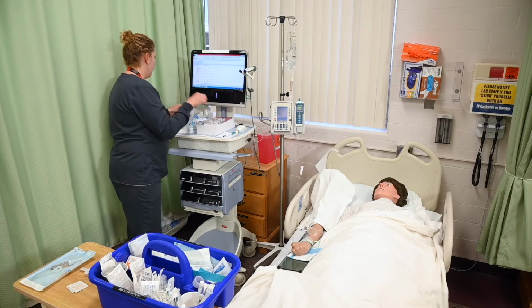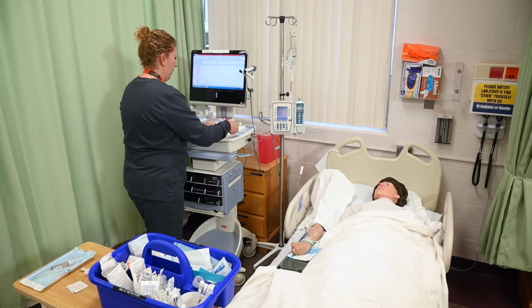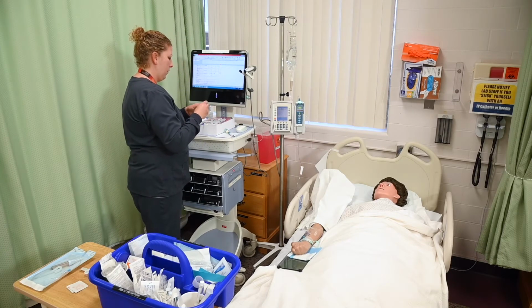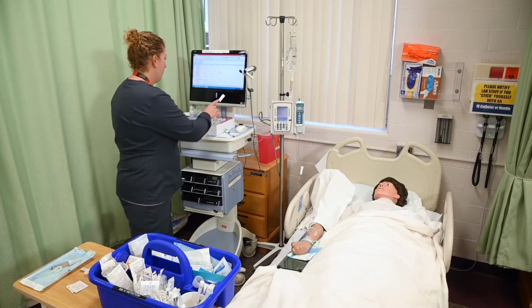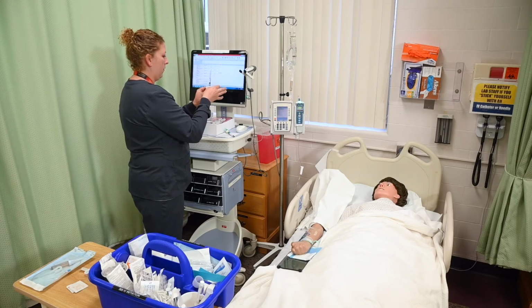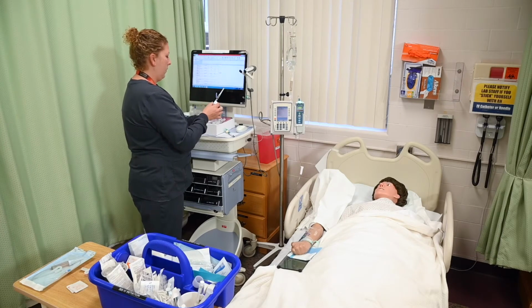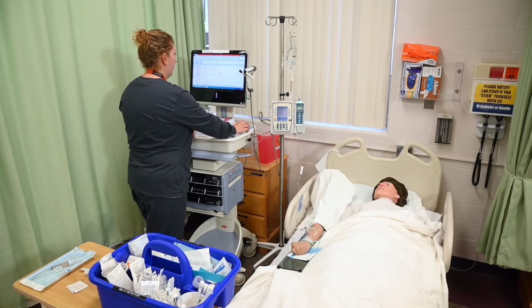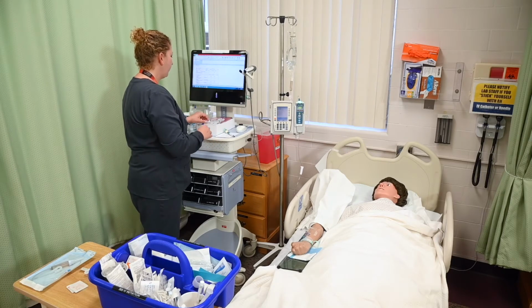She will now label the medication syringe with date, time, patient initials, her initials, along with the name and dose of the contents of the syringe. And Sarah has already performed the next step, which is calculating correct rate of IV Piggyback infusion. And she stated her findings.